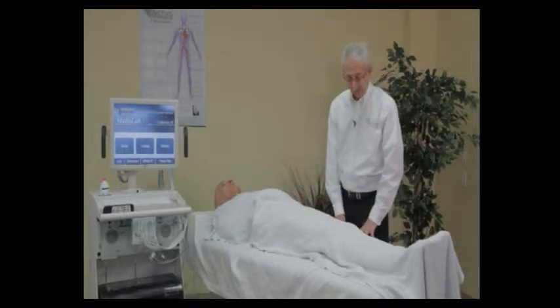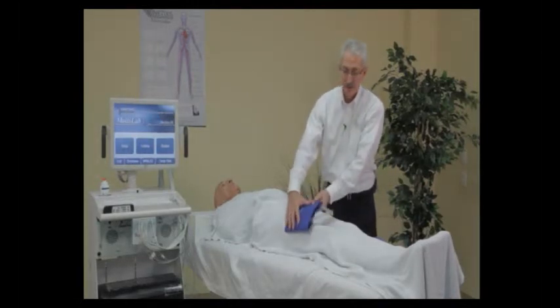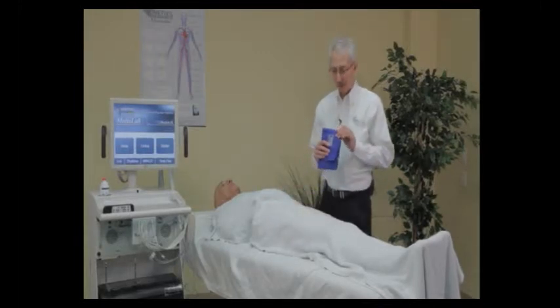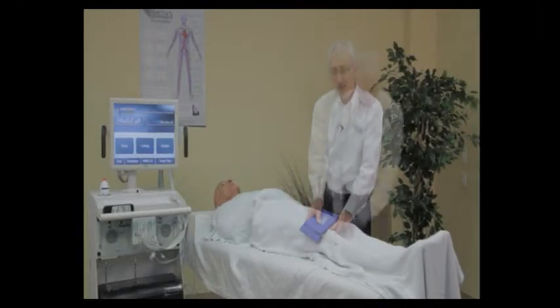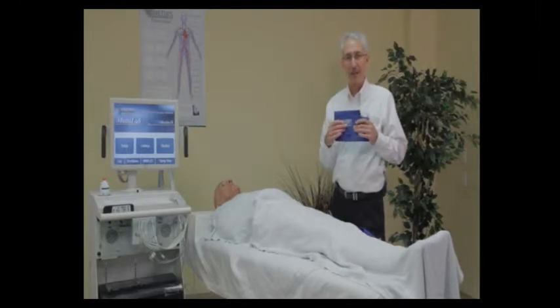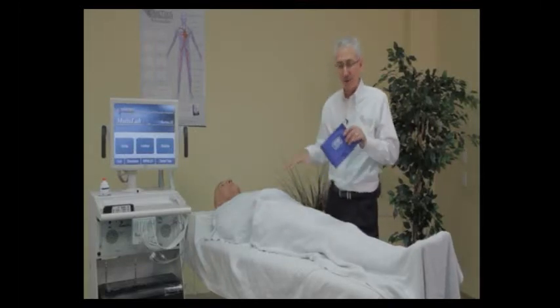Next let's talk about cuff sizing. Starting with the largest, we have the CC17 cuff — some people use this as a single cuff above the knee in the three-cuff method. Many use an SC12 cuff for the four-cuff method, placing one at the high thigh and one at the above-knee level. If you're performing the four-cuff method, make sure you can apply two SC12 cuffs with a space between them and the lower one is not covering the patella. Also remember there is a 120% ratio to maintain for accurate cuff pressures, so for a large thigh or arm you may elect to use a 12 centimeter cuff on that calf or arm.